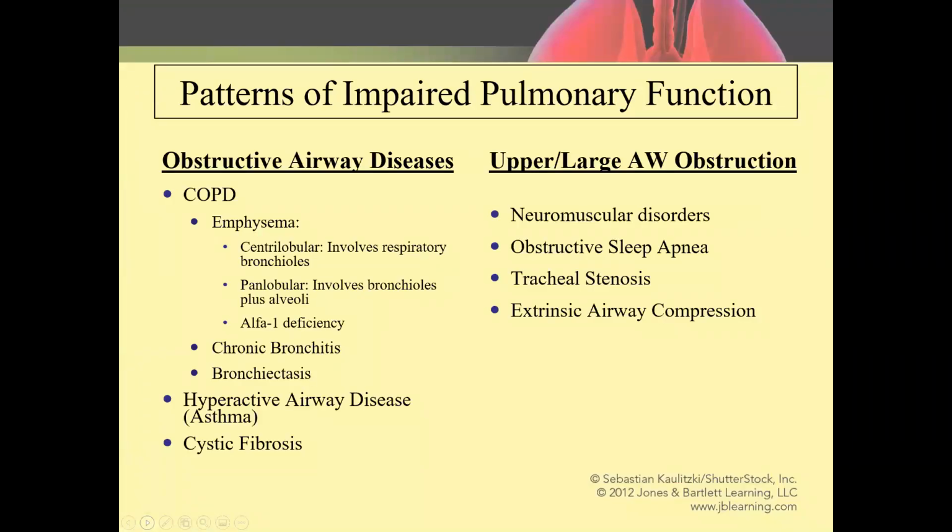Looking at some of the conditions. So that's some of the manifestations, okay, that your restrictive patient will tend to have, grossly speaking, lower volumes and either normal or higher flows. Okay, it's restrictive. Your obstructive patients will tend to have reduced flows but increased volumes. It's a gross simplification. It's not true 100% of the time.